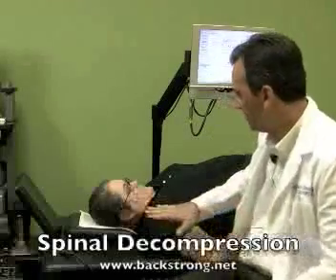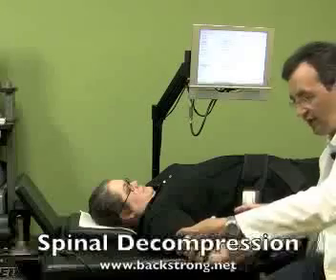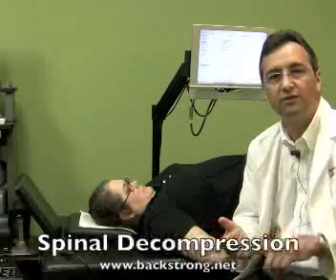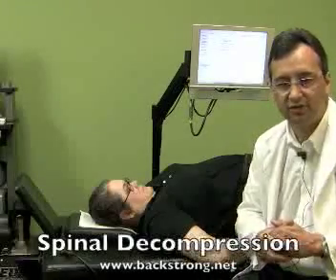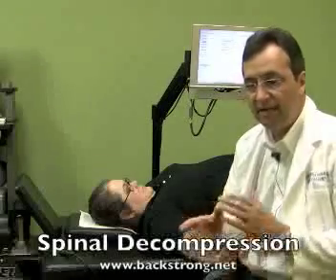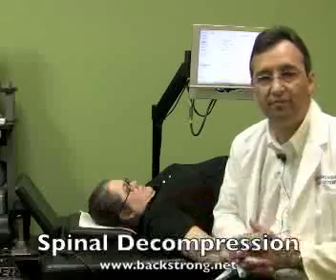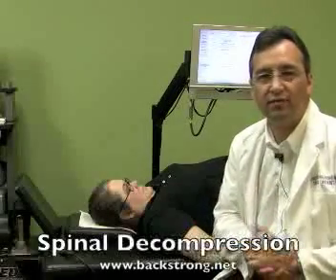So that's how it works mechanically. It's pulling apart to separate the lumbar vertebrae and get pressure off of the pain generators in the low back, i.e. the discs, nerves, and joints. And physiologically, it's initiating changes that are beneficial to the person for typically many months to several years of relief. And of course, they will have pain if they live long enough again. And again, you go back to do a little more decompression.